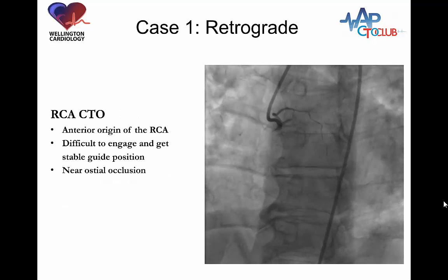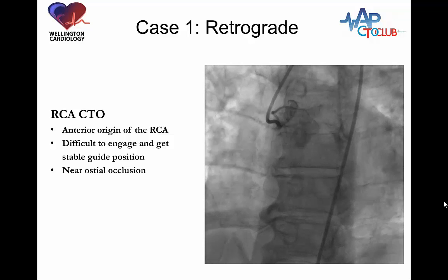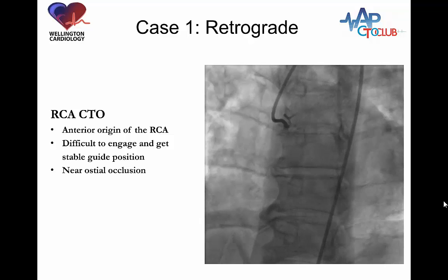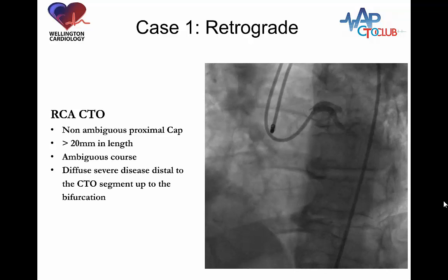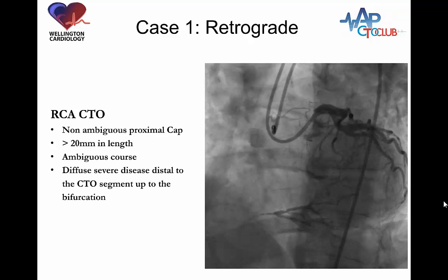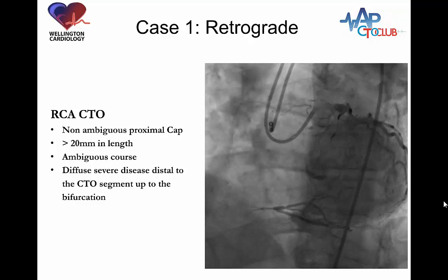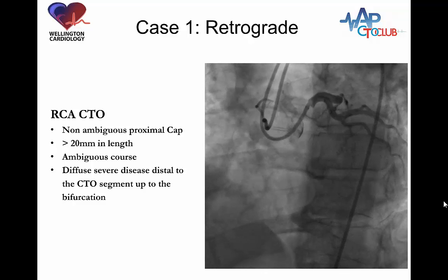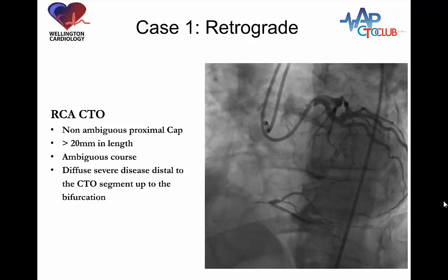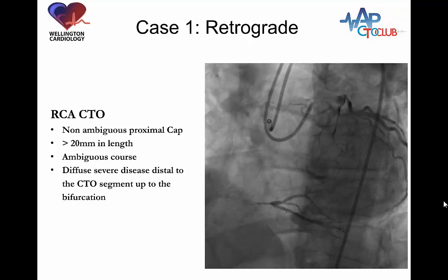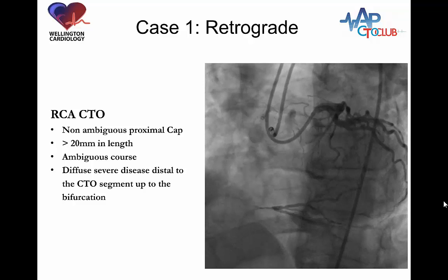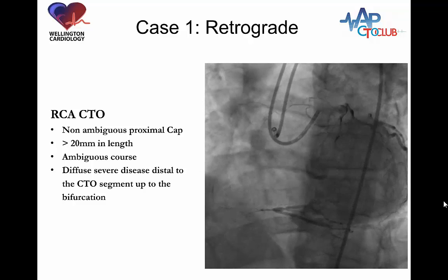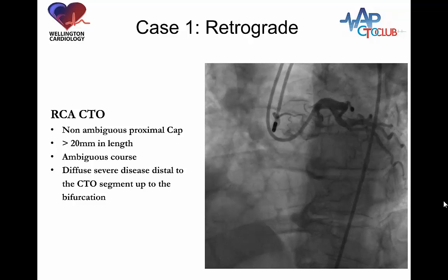Looking at the first angiogram, there is a near-osteal occlusion of the right coronary artery. The right coronary artery has an anterior takeoff which makes engagement difficult — this is an AL-1 guide. Bilateral injections demonstrate a long CTO with a diffuse segment of disease, a narrow channel just after the distal cap extending all the way to the bifurcation. Given the near-osteal location, the long segment of disease, and diffuse distal disease, this would be a retrograde case in any algorithm.